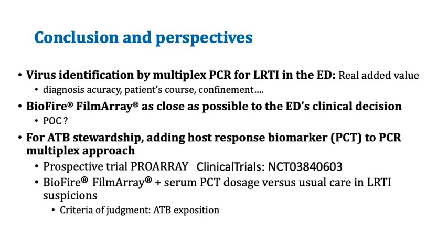This prospective trial will randomize patients coming to the emergency department with LRTI suspicion into a control arm with usual care and an interventional arm in which we will perform an on-site FilmArray respiratory panel on the nasal swab and a PCT measurement, with an algorithm to help the emergency physician decide whether or not to give antibiotics. Our criterion of judgment will be antibiotic exposure.